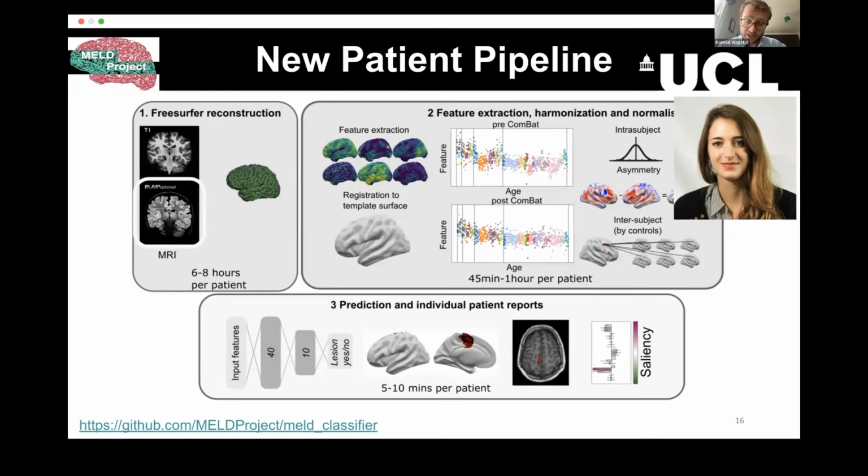Do you mean specifically intrinsic curvature? Yeah. So that's a feature that we developed to try and capture the folding abnormalities. So if there is a kind of abnormal folding pattern, that's the thing that tends to pick it up best. Okay. So if you see it as an important feature, the thing you're really looking for is kind of an asymmetry in the folding pattern. Yeah. Okay. Thank you. Great question. Any other questions at this point?